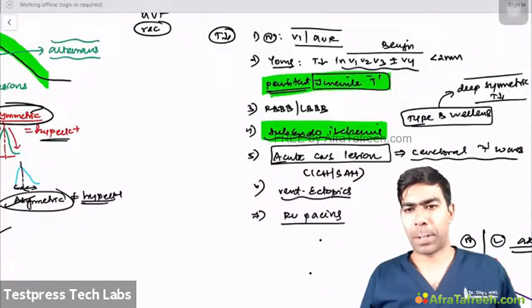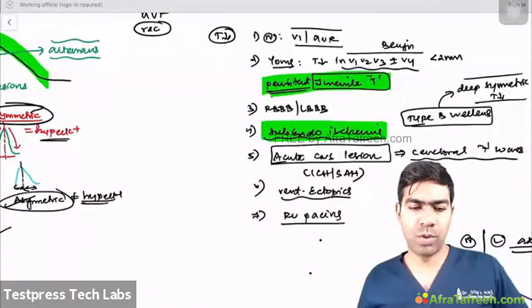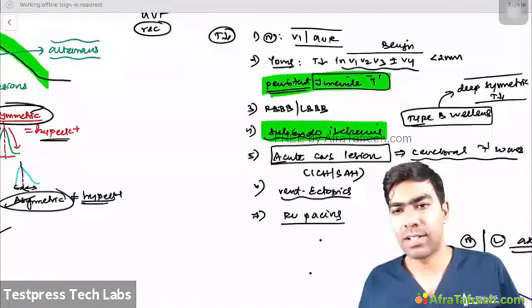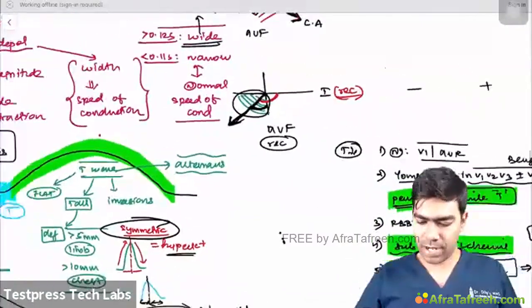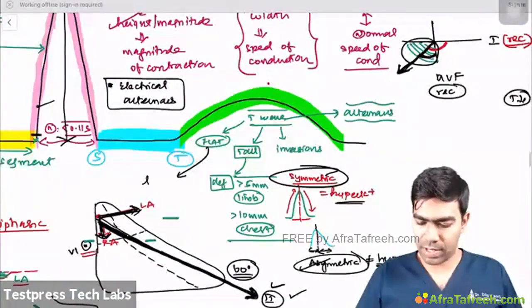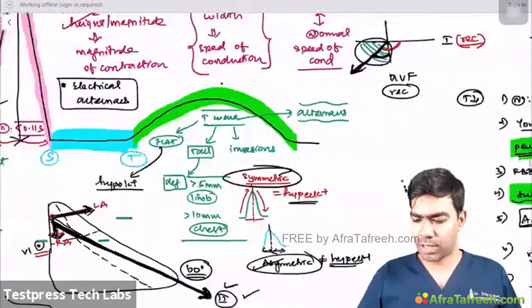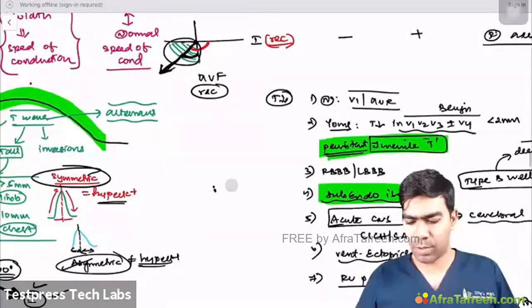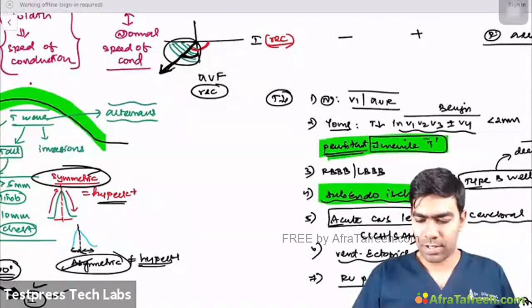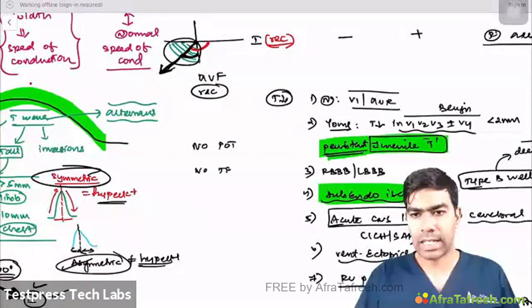Okay. Yes, you have found out. So two things are there. One is the QT interval and second is flat T waves, once again, hypokalemia. Flat T waves, whenever you see flat T, you talk about hypokalemia. Hypokalemia has a mnemonic, isn't it? One of the worst mnemonics you can see is in hypokalemia. What is the worst mnemonic that you can see in hypokalemia? There's a mnemonic called no pot, no tea.